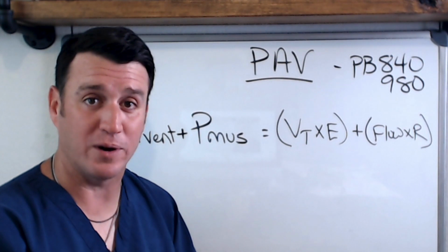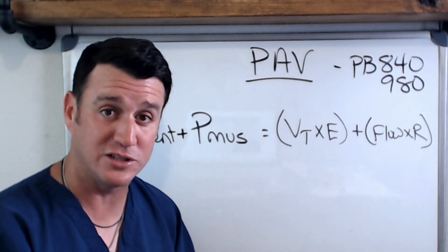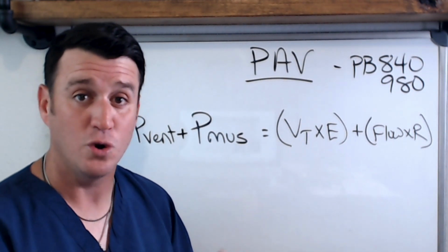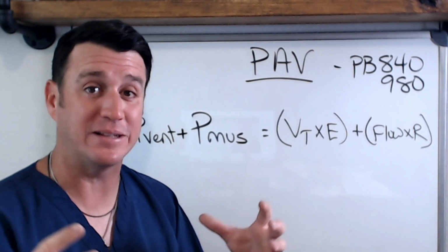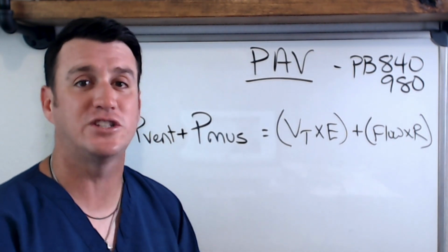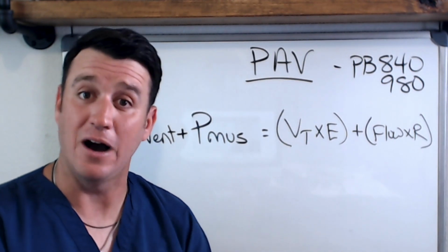Compliance is on inspiration, elastance is on exhalation. How compliant are the lungs to receive volume, to receive pressure? And then once exhalation happens, how quick are they to return back to normal state? That's elastance, okay?